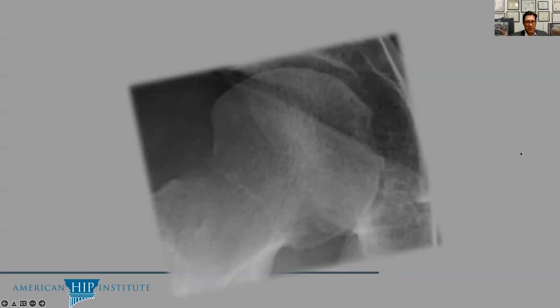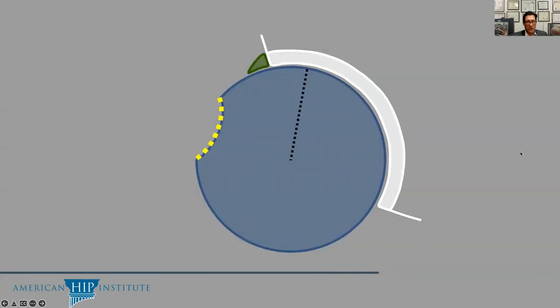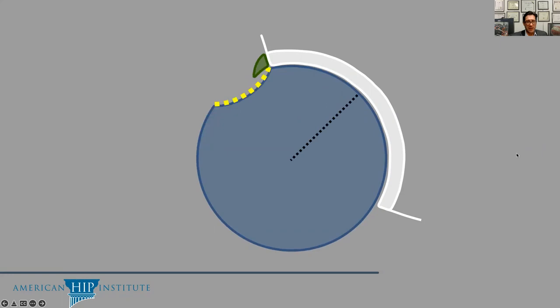Here's an example of an over-resection. And when this over-resection enters the joint, when the patient sits down, look what happens. The labrum is no longer in contact with the femoral neck, and that breaks the seal. So if we break the seal, then we do not have the chondroprotective fluid film in the joint, and we do not have the stability that the labrum confers. And a patient like this may feel locking or catching or pain every time they sit and stand or bend their hip and go from a flexed to an extended position. Here again is this breaking of the seal.